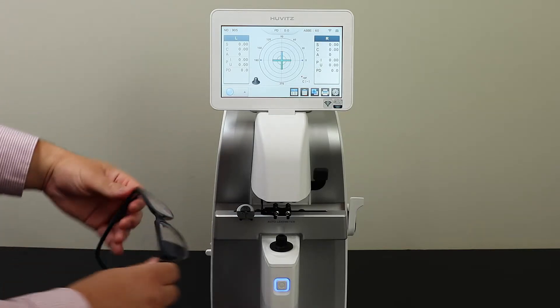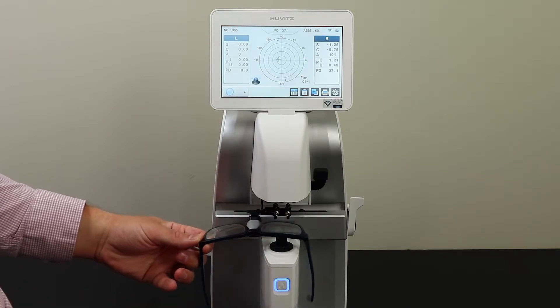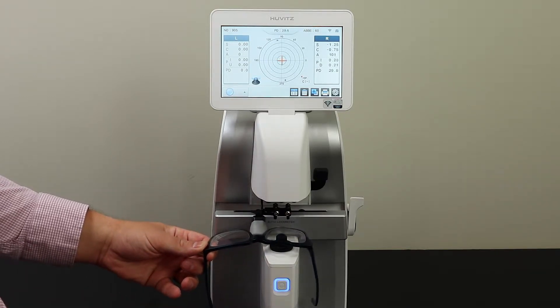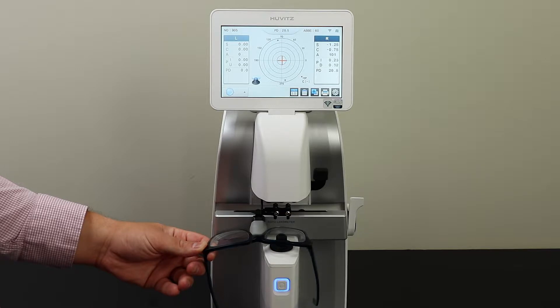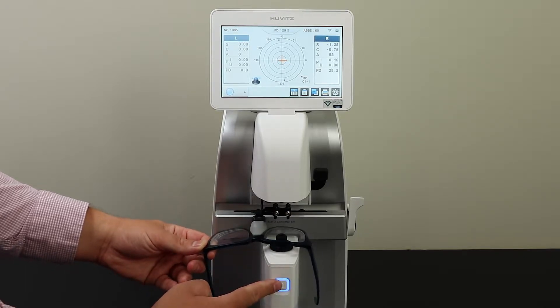Start by taking your frames and placing them on the nose pad. Slide your frames over the lens until you line up an orange crosshair. Once this is lined up, press the blue button to get your first reading.